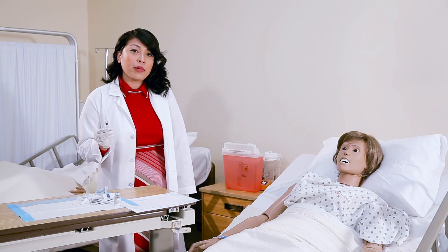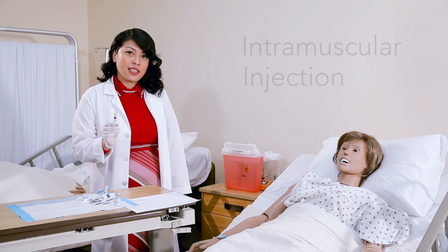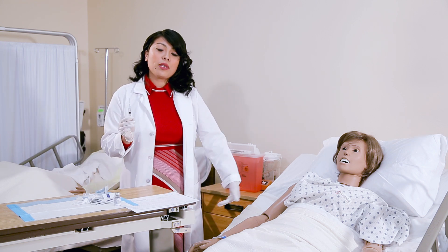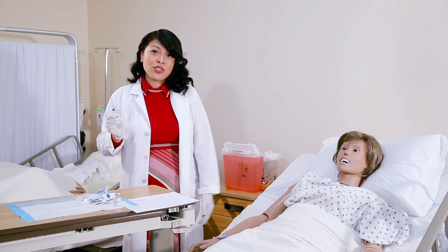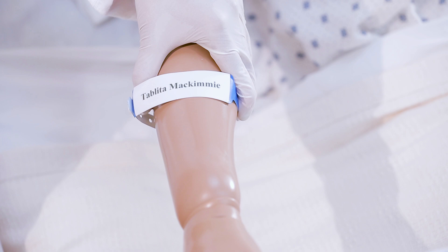Now I'm going to show you the proper procedure of inserting an IM injection in the deltoid muscle. First, you want to make sure that on the MAR it matches the medication with the patient's name. Don't forget the patient's six rights. Double check the MAR and also the name badge to make sure that it matches. Of course, you've already talked to your patient about the medication and also the administration procedure.